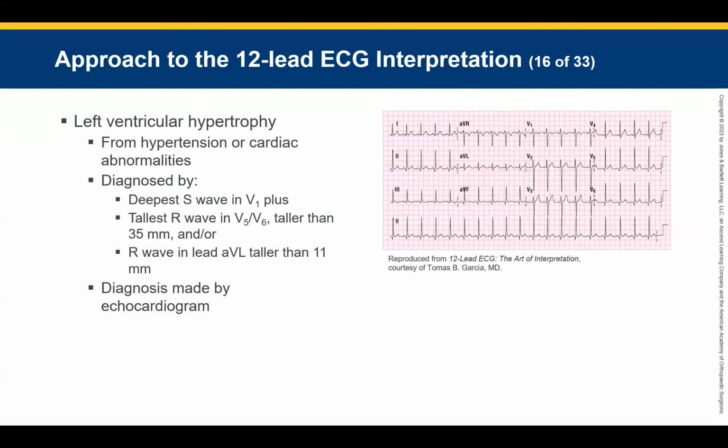All right. V1 is septal. And V2 are septal. They're contiguous leads. V3 is anterior. And V4 is anterior. They're contiguous leads. V5 and V6 are also lateral. We're gonna finish this up here in a second, but I'm gonna let everybody catch up before I talk anymore.